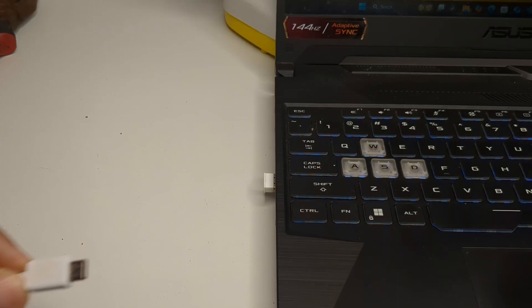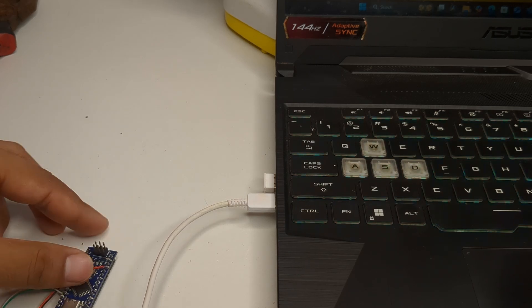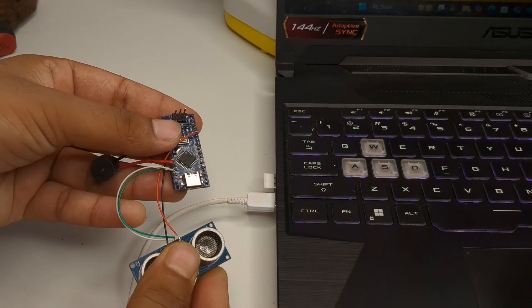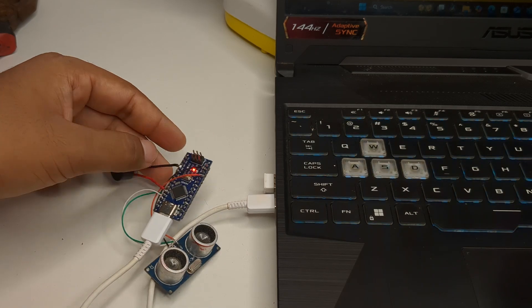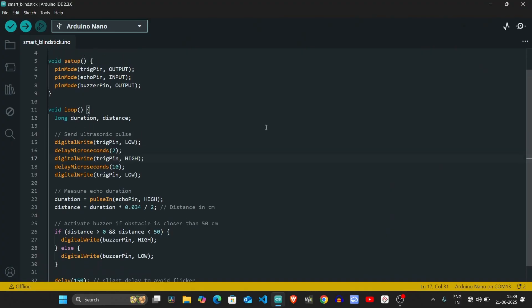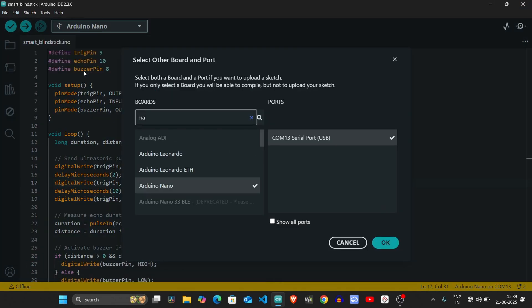After soldering, I connected the Arduino to my laptop. Then I opened Arduino IDE, selected the correct board and port, and uploaded the code to the Arduino.